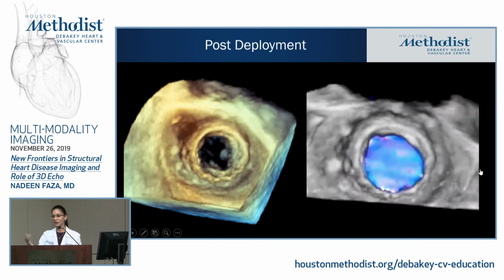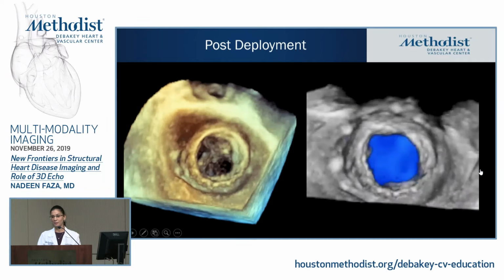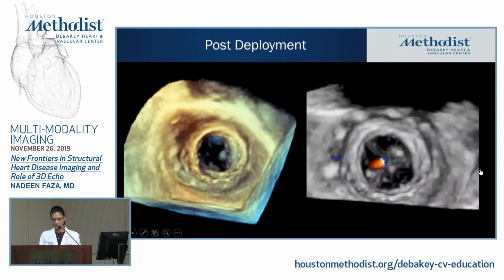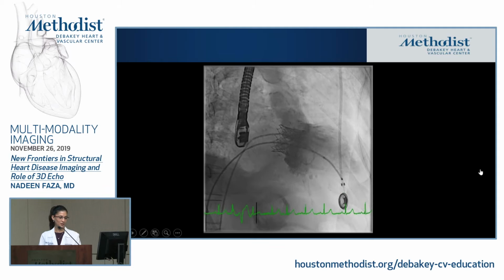So again, whenever you have a patient who's symptomatic with degenerative bioprosthetic valves, it's important to evaluate their surgical risks, because if they are at a low surgical risk, then that would be the option. Again, fluoroscopy.